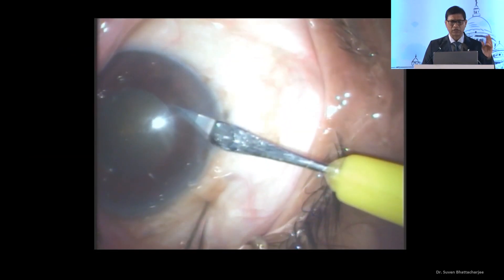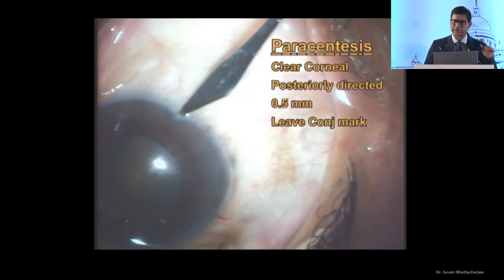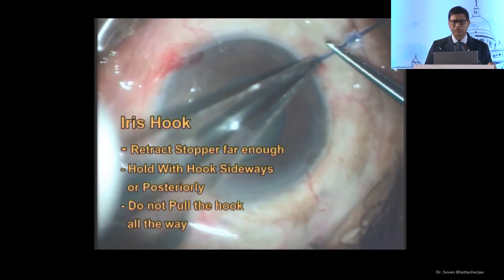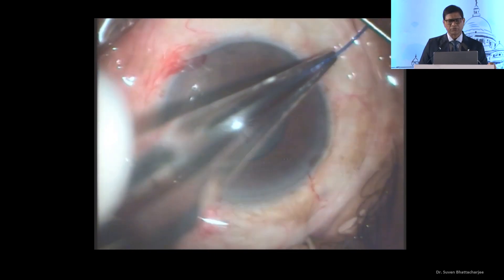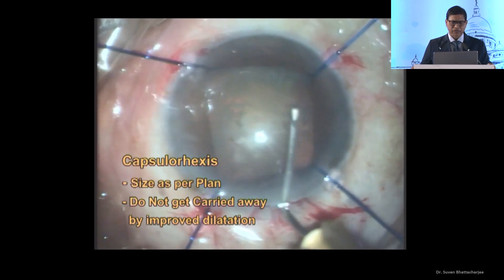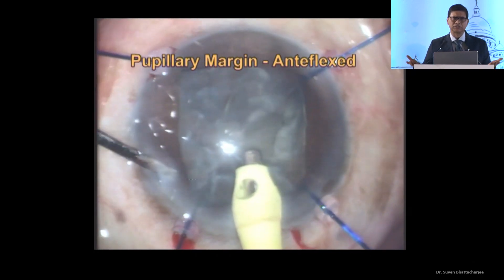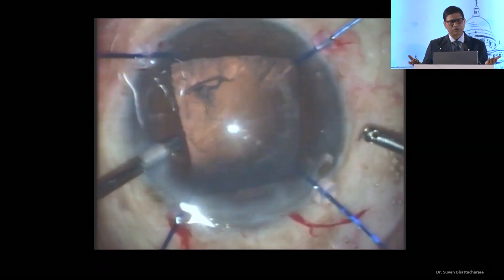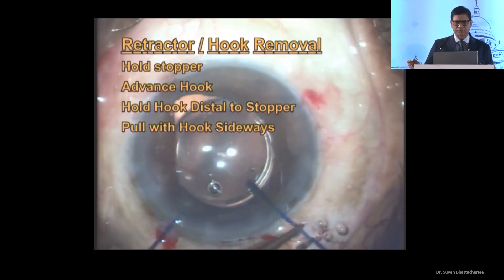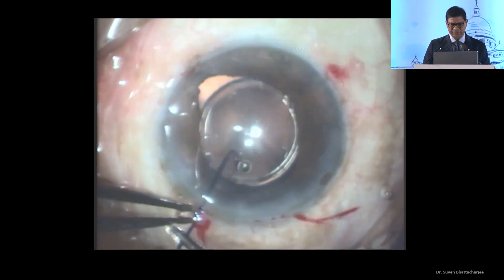A little bit about iris hooks. I've not done iris hooks in a very long time — this is a very old video. I like to keep the paracentesis in the clear cornea directed a bit posteriorly, and I make nicks in the conjunctiva so you can find those incisions later. It's a good idea to retract the stopper well in advance. Hook the pupil margin and do not retract it all the way — this is a little over-retracted. Keep the capsulorrhexis to your plan; do not get carried away by the pupil expansion. Remember that the pupil margin is now elevated to the limbal plane and there is anti-flexion of the iris, so every device that goes in will knock that iris and lead to trauma — be mindful of that. For removal, hold the stopper, push and advance the iris hook, then pull it out — it momentarily straightens and comes out very easily.